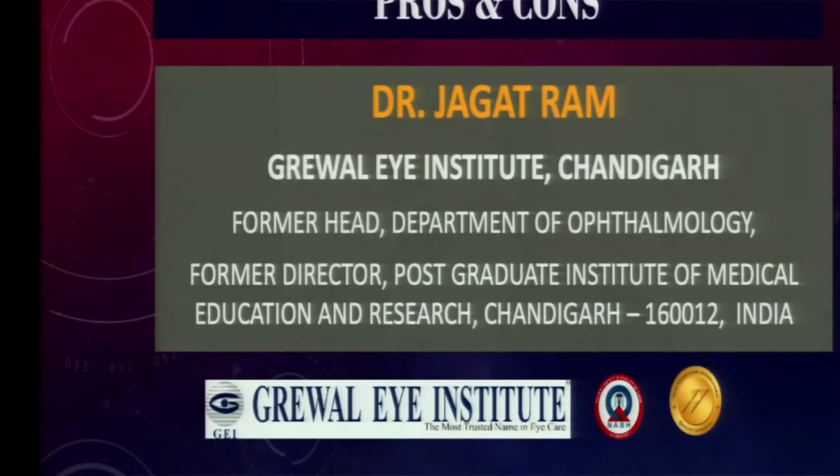First of all, I am thankful to Dr. Shri Ganesh for giving me this opportunity to speak on intraoperative aberrometry, pros and cons. Please put on the slide.